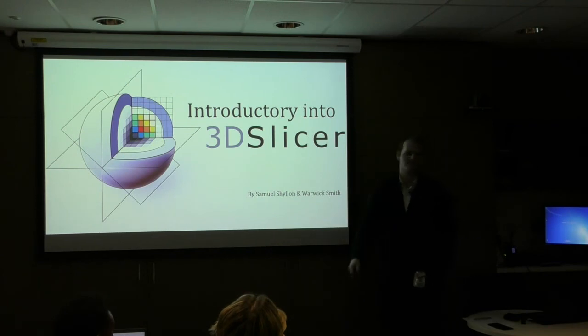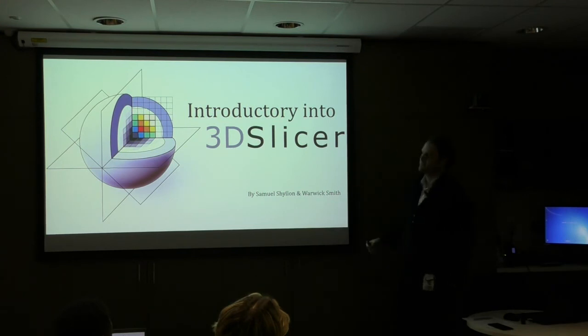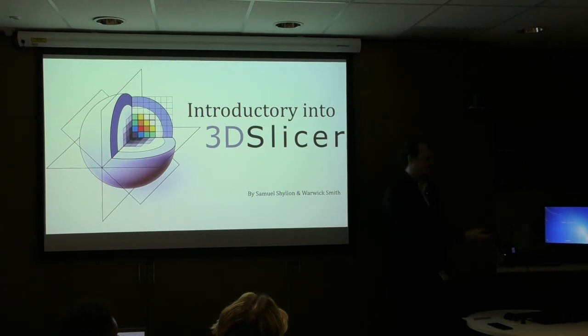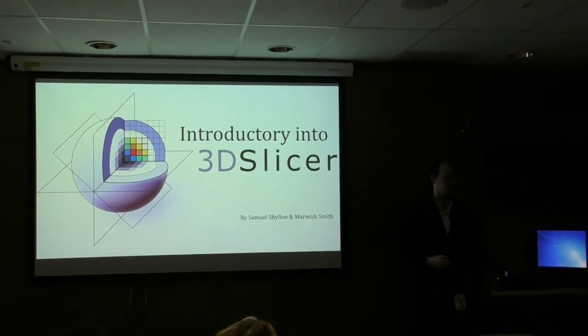We're going to talk to you a little bit about 3D Slicer. We've used it in our master's research, and hopefully you can learn something from the application of this open source software. So my name is Warwick and that's Sam.